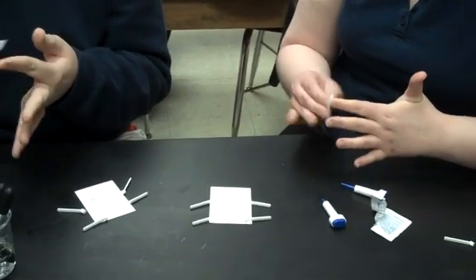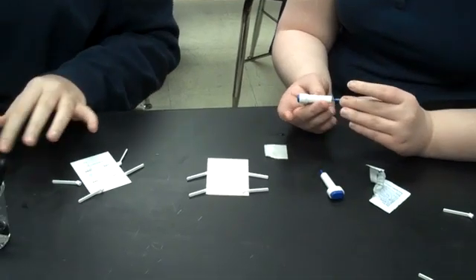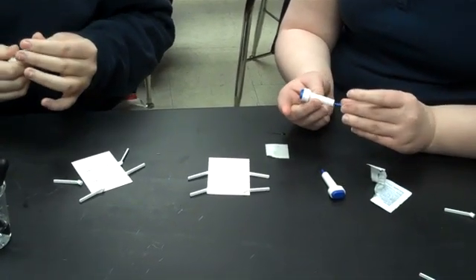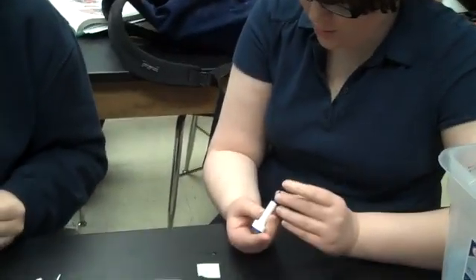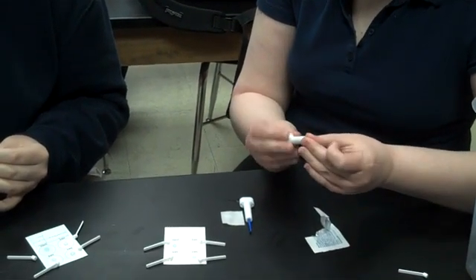Stephanie brought us in some lancets that I've never seen before, so hopefully she knows how to work them. I think this is supposed to come out — maybe you just do it through. Do you twist the top off to get the needle to be exposed?